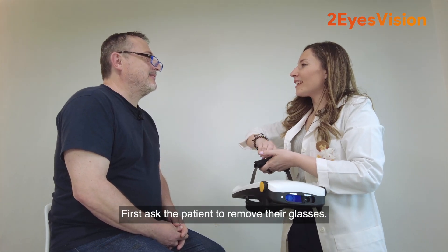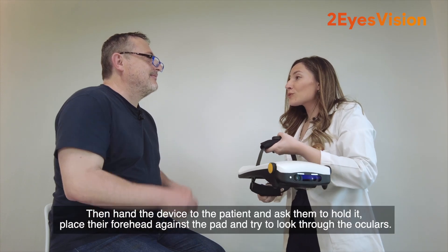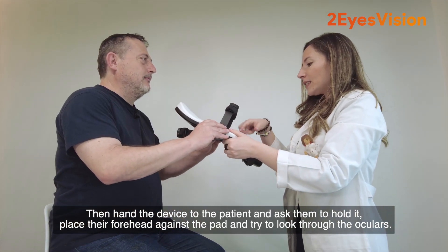First, ask the patient to remove their glasses. Then hand the device to the patient and ask them to hold it, place their forehead against the pad, and try to look through the oculars.